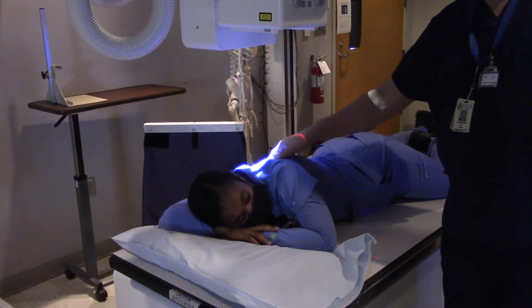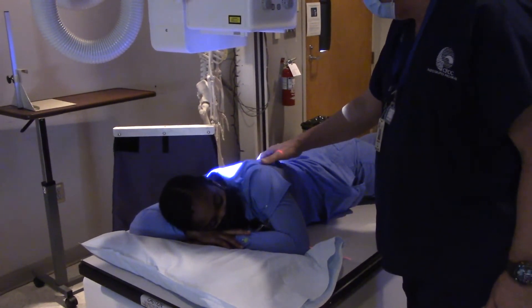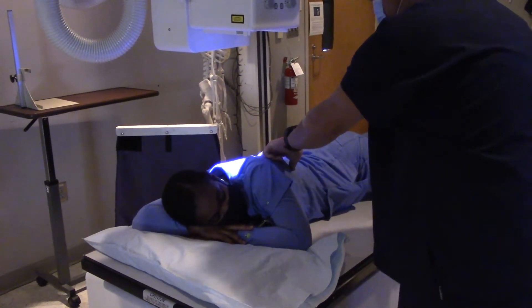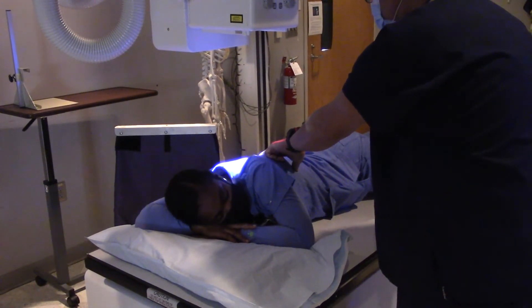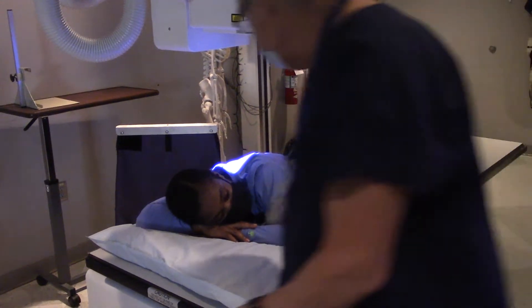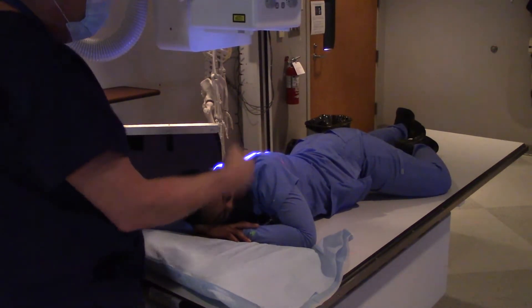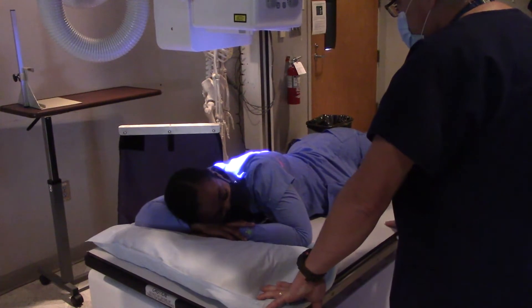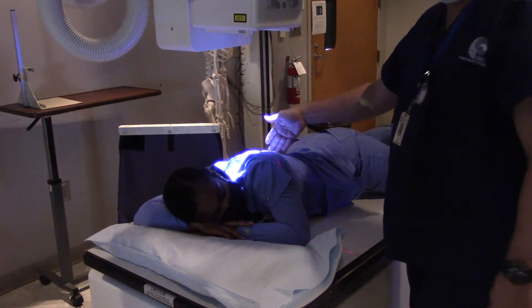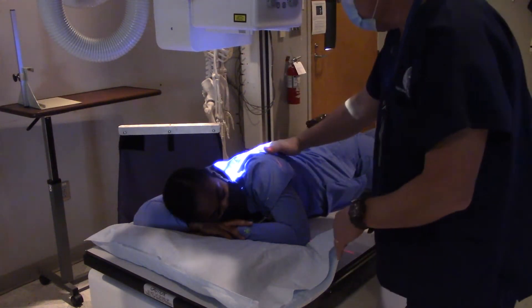T6 is just above T7. How do I find T7? The lower margin — lower angle of the scapula. Right there is the lower angle of the scapula, so I'm just going to go about one inch above that. Now I need to be in line basically with the middle of the patient's body. I can see her neck is right here, and I need to shift her that way just a little bit, to make sure I include her throat all the way down to the cardiac sphincter where the esophagus goes into the stomach.